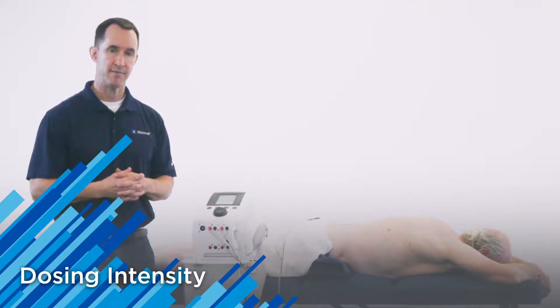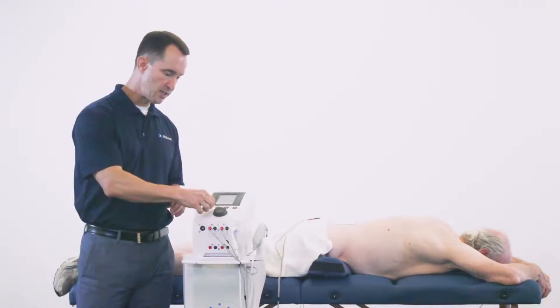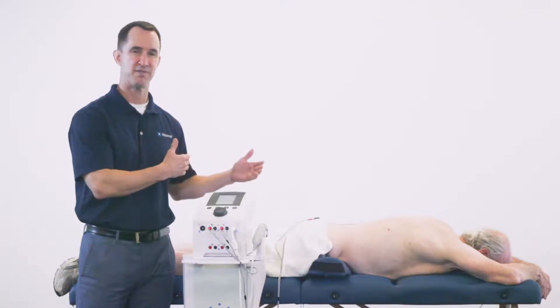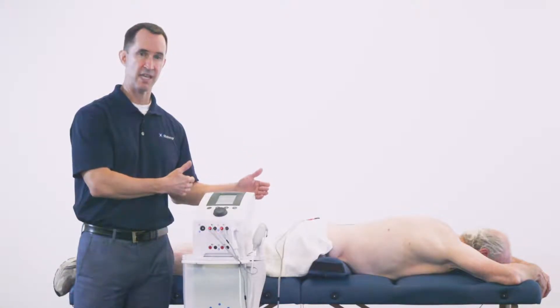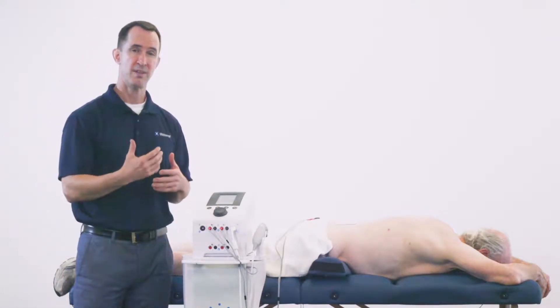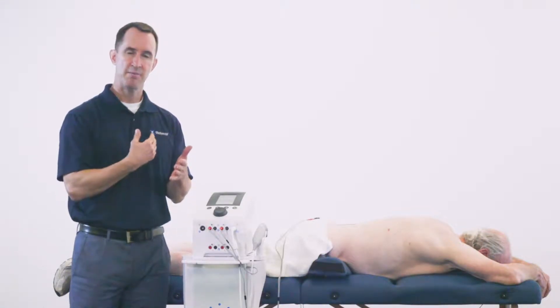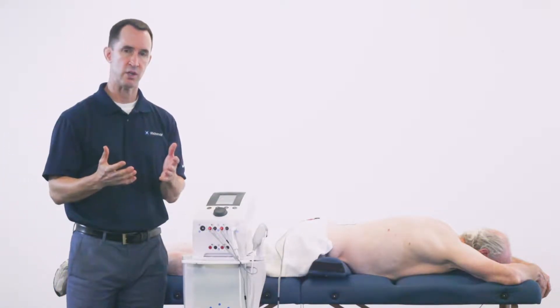Dosing your intensity is a very important consideration. Stay away from dosing to a set number on the device — instead, look for those physiological responses of the tissue and nerves. Communicate with your patient about when they feel a tingling or vibrating sensation, and then when they start to feel that pulsating, vibrating sensation, because we're looking for that twitch-level response in this particular approach.